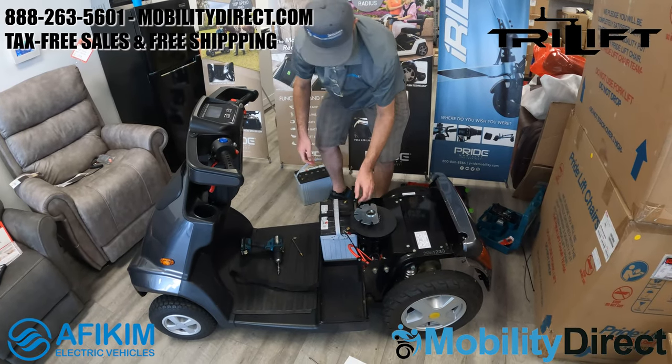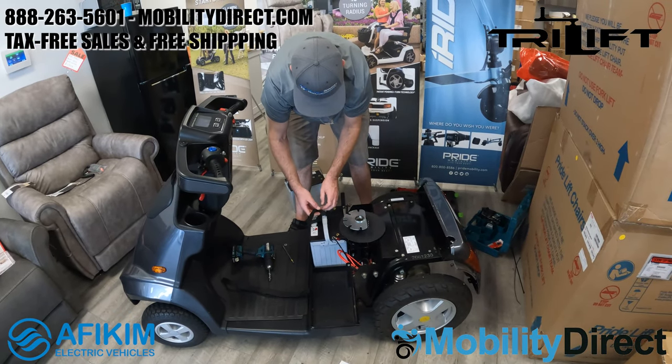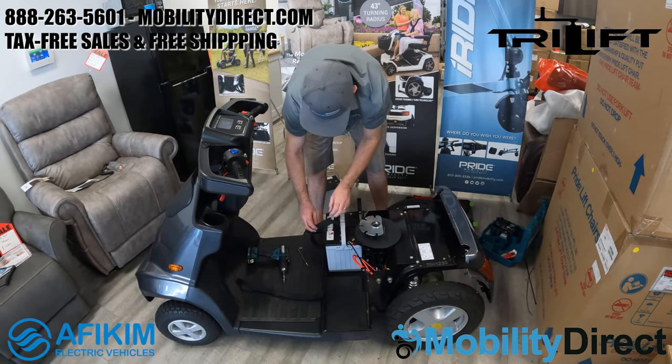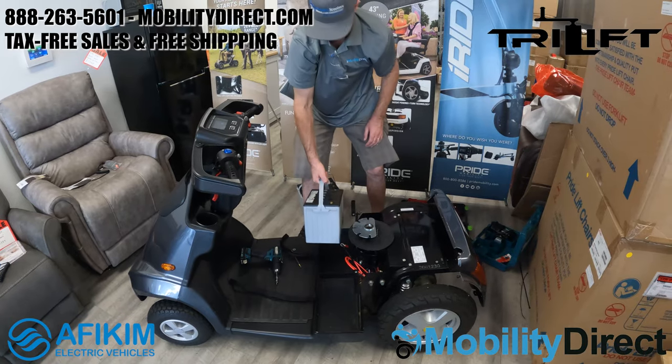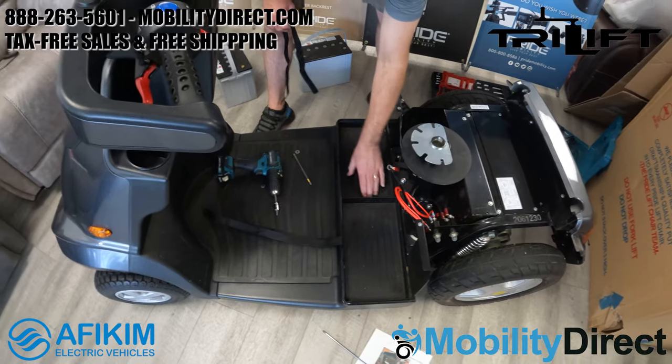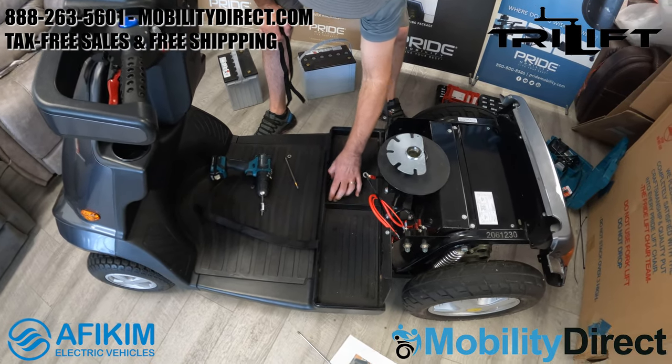Here we're just removing each battery one at a time. There are some straps that hold the batteries in place. You'll want to make sure to remove those and restrap the batteries when you go to put them back on. If you need to change the batteries, this is really all you need to do as well — just reconnect your batteries.